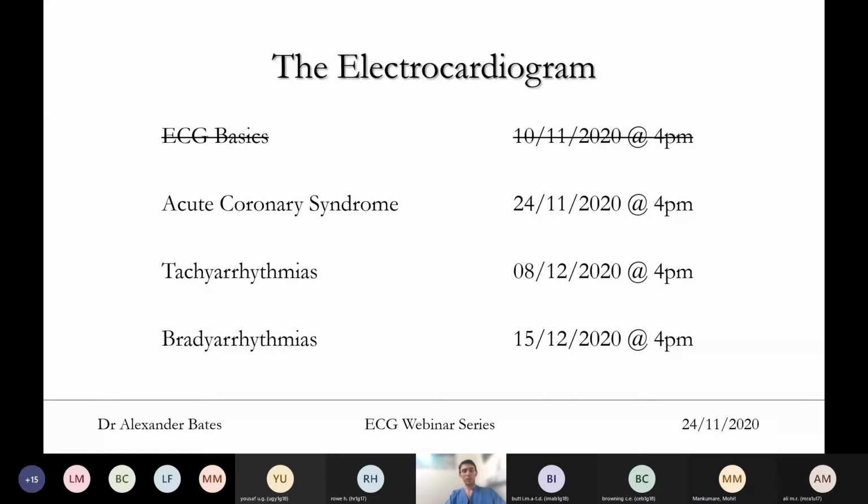Now, this week we are going to cover acute coronary syndrome, and of course, acute coronary syndrome is something that, particularly when you're just starting out as a doctor, you worry about quite a lot, because you're worried about missing the diagnosis. You're worried about the complications that might ensue from ACS, and often people are worried about calling the cardiology registrar, which isn't something that we think is right. But hopefully this lecture can give you a bit of confidence with interpreting ECGs and with picking up the phone and talking to us, and we're always very willing to do that.